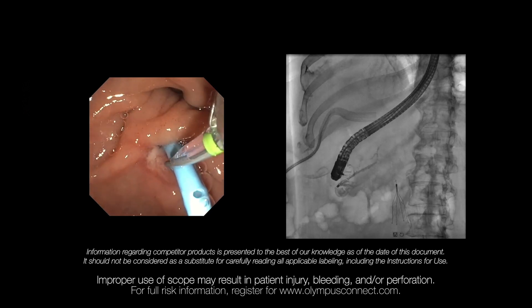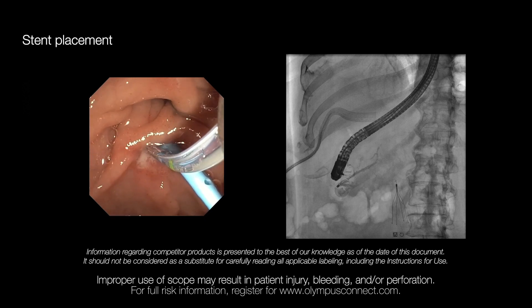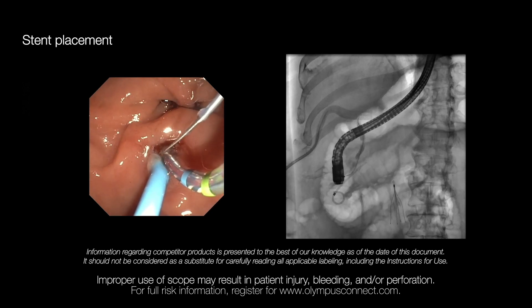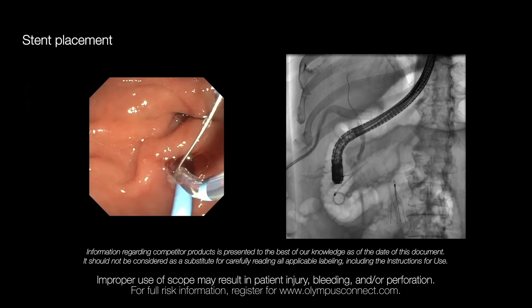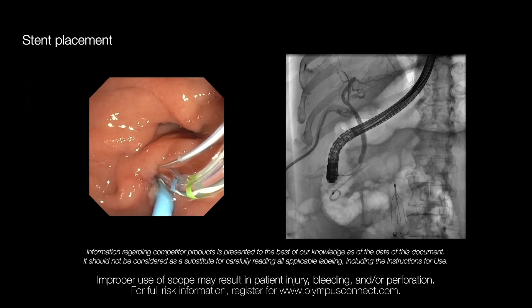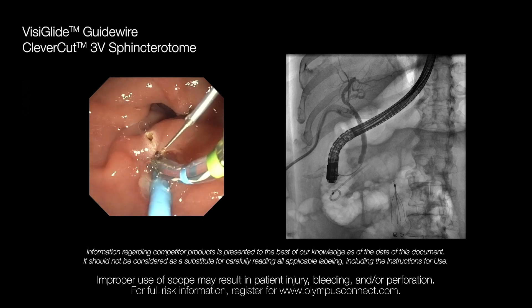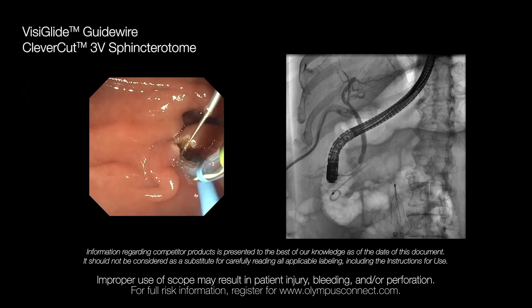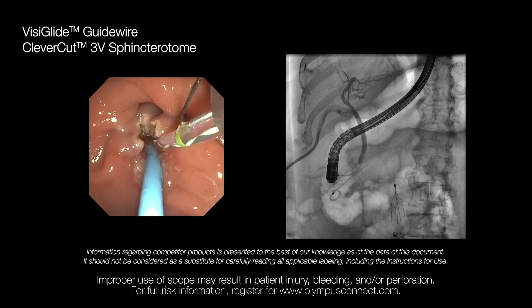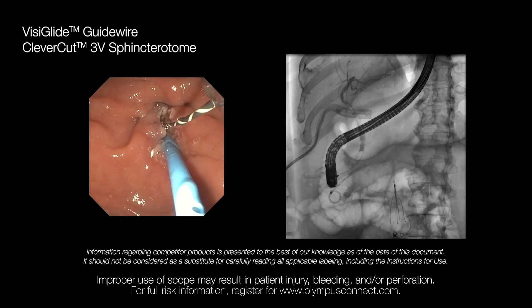This is a patient who had a bile leak and had an attempted ERCP performed at an outside facility. However, they were not able to cannulate the bile duct. They placed a pancreatic stent and the patient was referred to us. Cannulation was achieved with the CleverCut sphincterotome and VisiGlide wire. Sphincterotomy is being performed. The cholangiogram showed leakage of contrast at the cystic duct stump area. After the sphincterotomy is performed, the sphincterotome is removed.